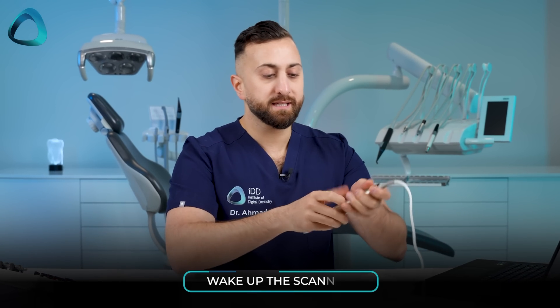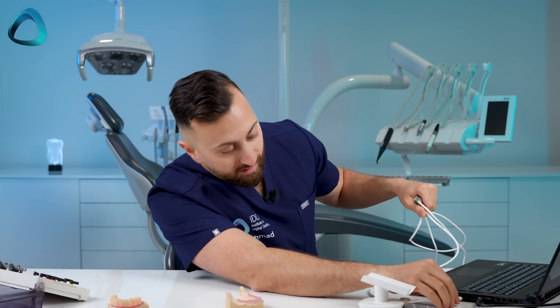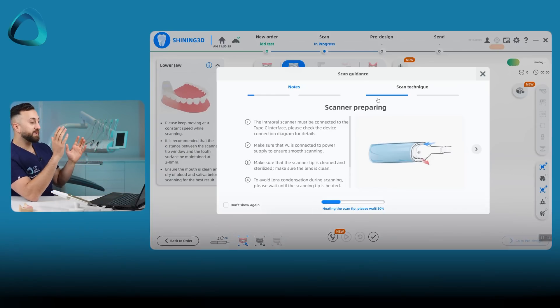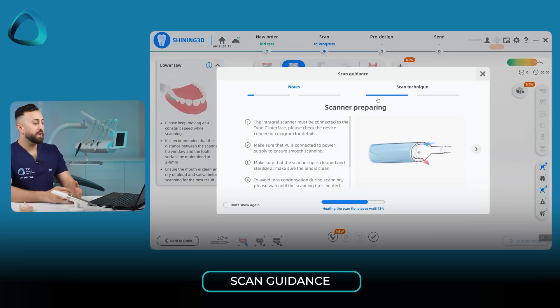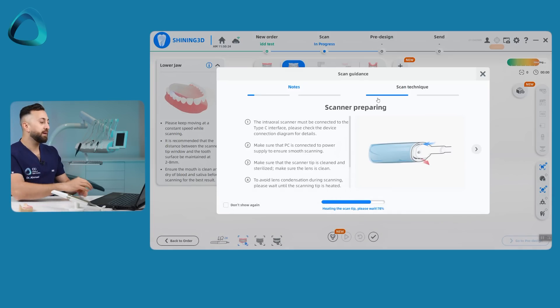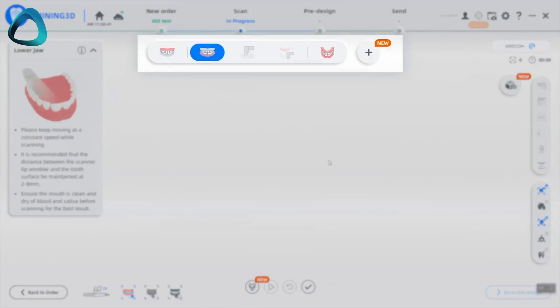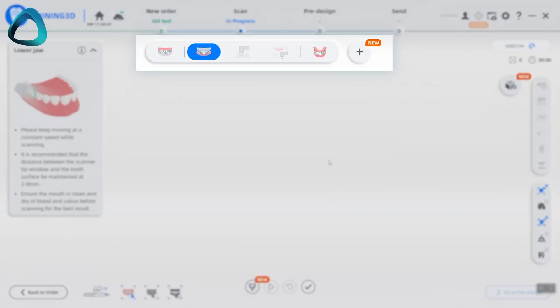Now it says to wake up the scanner. I'm going to grab the scanner — it is a simple USB-C connection. What you will notice is instantly the scanner wakes up with a green light, and then we can click scan. Now it says scan guidance; the software shows you a bunch of little tips on how to get the scanner going and how to scan properly. We're going to close these tips off, and what you see is a really interesting thing at the top — because this is a brand new software workflow for full arch intraoral photogrammetry.